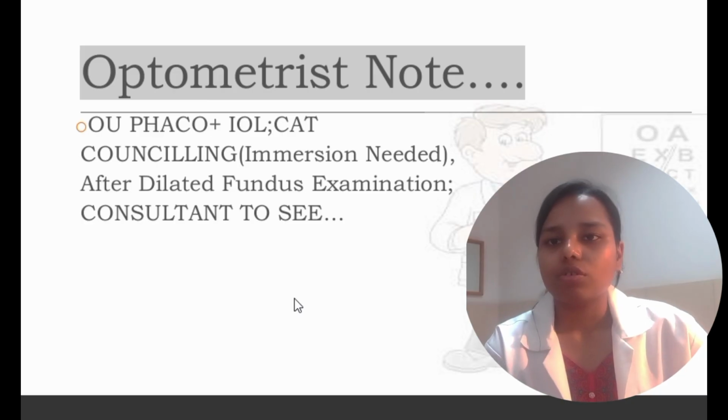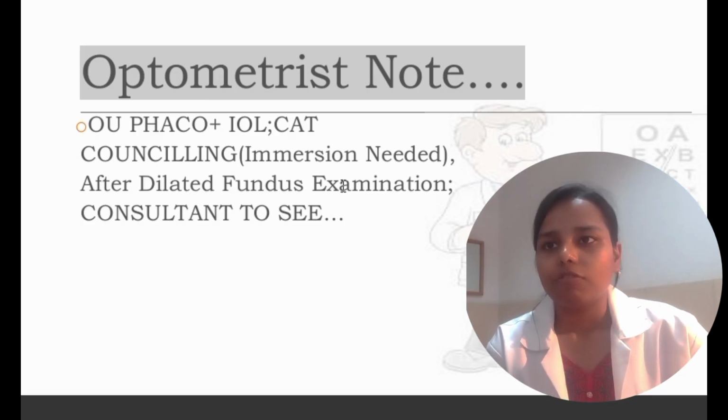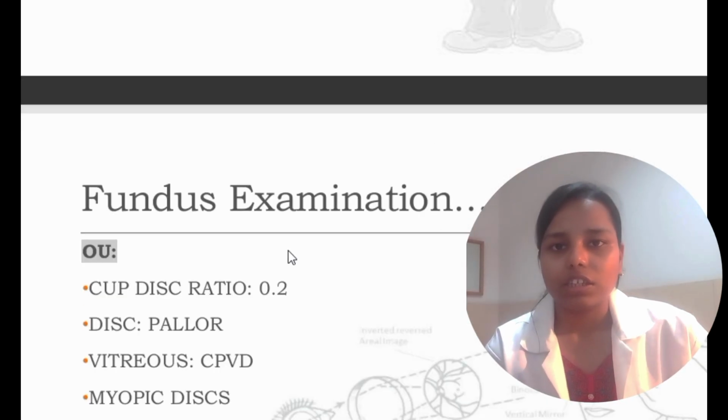Moving to the next slide, here comes the optometrist note which I put for that patient: OU phaco plus IOL cataract counseling. This patient has almost total cataract, so immersion is needed. After dilating, fundus examination, consultant to please see.